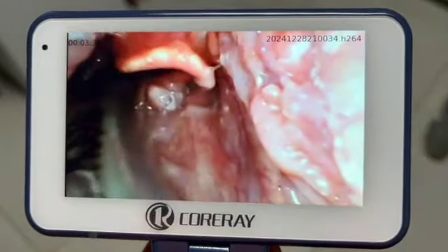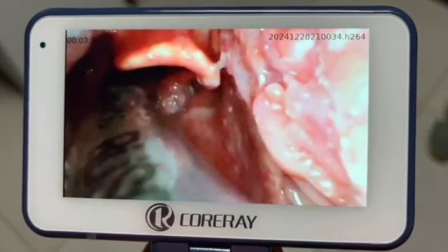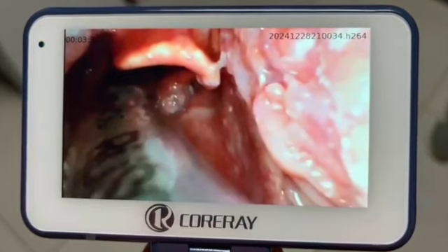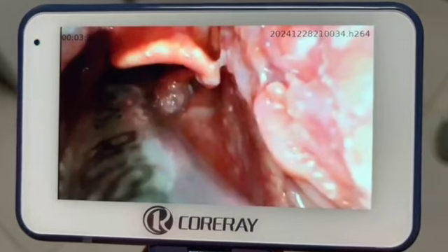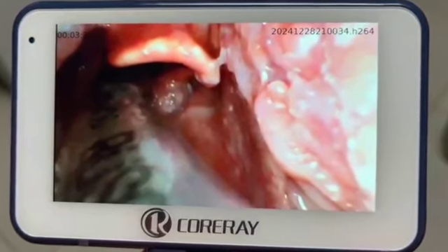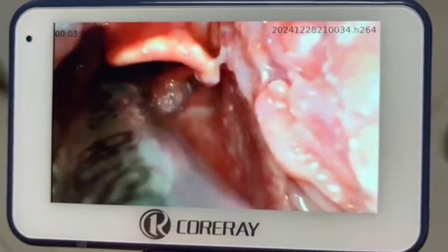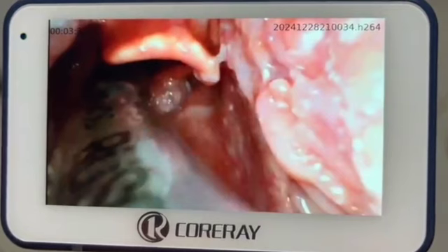You'll also notice that the depth of the tube was quite intense, but we were just happy to have the tube in, and so it sort of went past that little black marking. And as soon as we started our assessment, we noticed that we were about 1 centimeter or 2 too deep, and immediately pulled back with the end-tidal CO2 attached to the tube, making sure that we didn't lose the CO2 at any point, and so that we had much better air entry bilaterally.